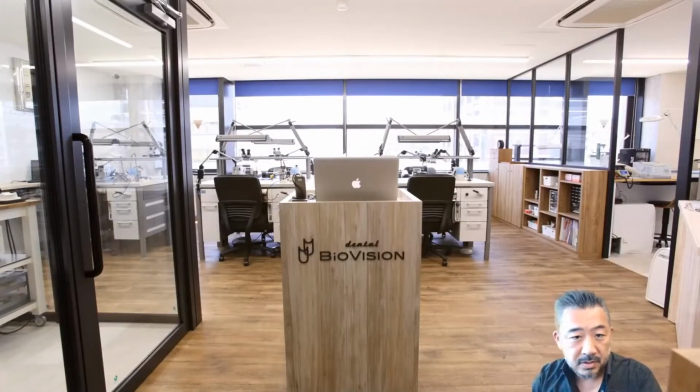This is another floor. This is the main room, and the glass partition on the left is a room for porcelain work and zirconia staining work. Our company has had a big revolution in the last few years. Currently, we don't work with metal anymore. I'm seriously saying, we haven't made an implant superstructure that requires a metal frame, porcelain fused to metal, or a metal crown. Over 90% of all work is done with zirconia.